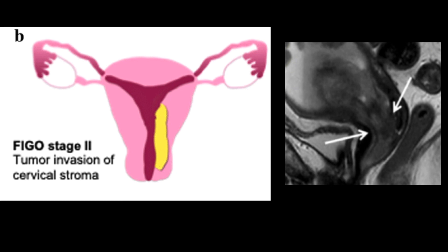Stage 2 is where there is cervical stromal invasion, as in the initial case shown in this video. This is best evaluated on post-contrast imaging two to three minutes after injection, and will be seen as lack of enhancement in the normal cervical mucosa. Stage 2 changes management from a total abdominal hysterectomy to a radical hysterectomy and pre-op radiation to the cervix.